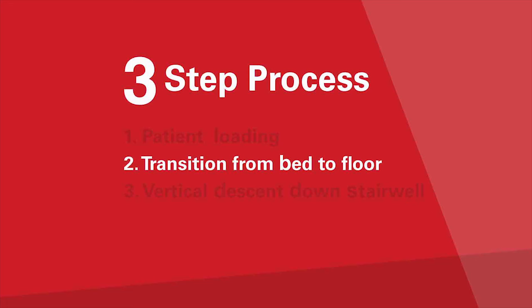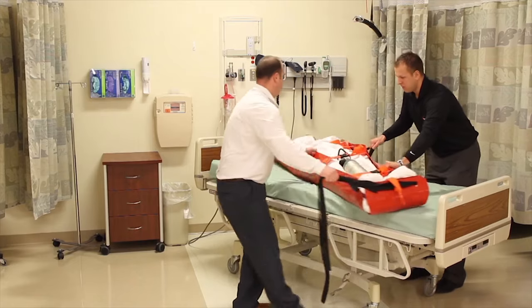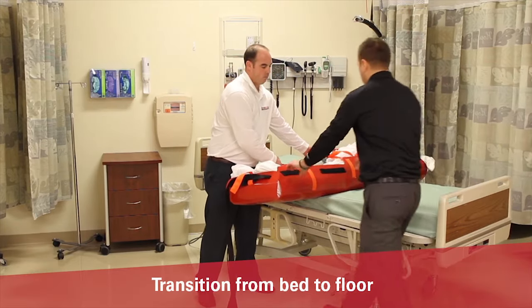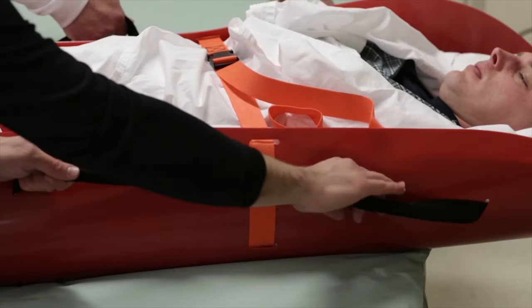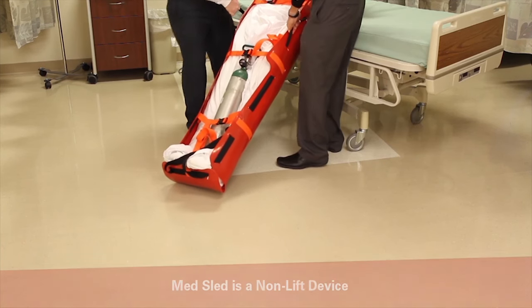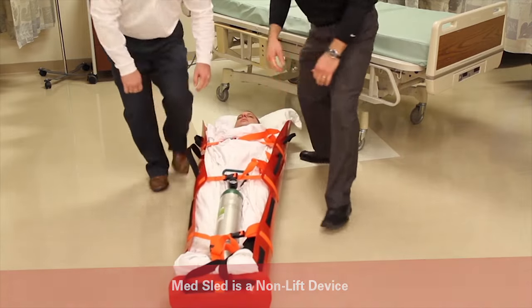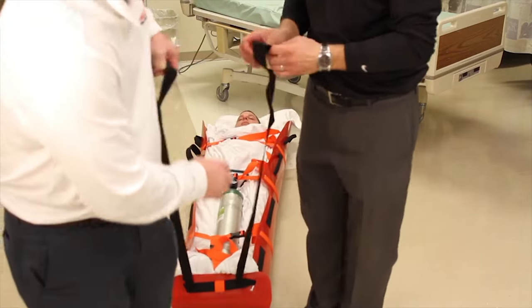Prior to moving the patient off the bed, ensure that the bed wheels are locked. Position the foot end of the sled toward the nearest exit. If this requires you to move the footboard, do so. Using the perimeter tether handles on both sides of the sled, slide the patient, allowing gravity to lower the foot end of the sled to the ground. Once the foot end has reached the floor, gently lower the head end. The patient is now ready to be pulled to the protocol stairwell exit for vertical descent down the stairs.